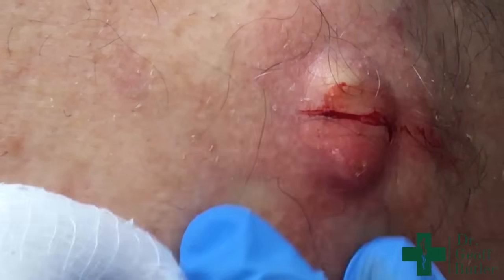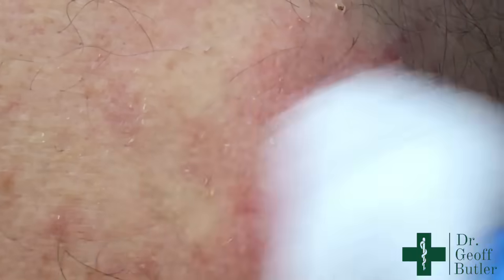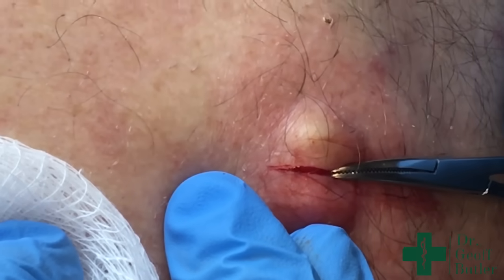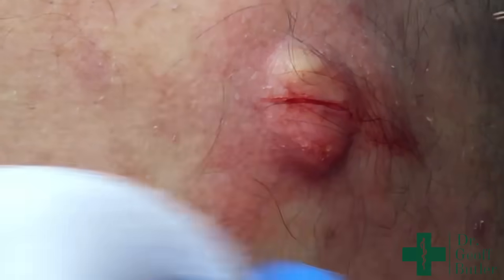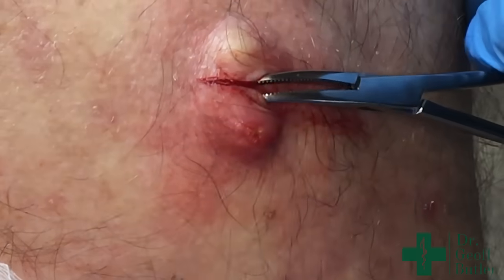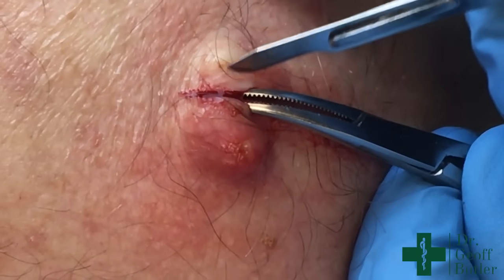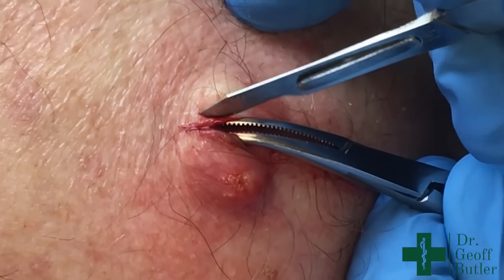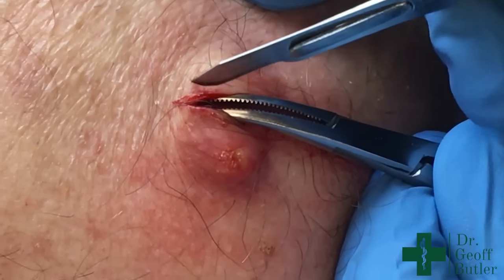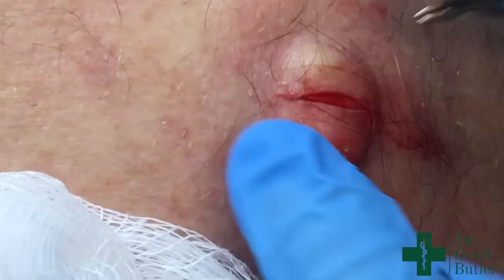Let's see there — that's open. Now you can see on this side it's started to open up. While this side wasn't open enough, this side actually is. What I'll do — and you'll see me do this — these are curved crylies that we use. I open it up so it protects the underlying space, and I'll just use that and extend it along, just so that I'm at the right level and I don't compromise the cyst at all.